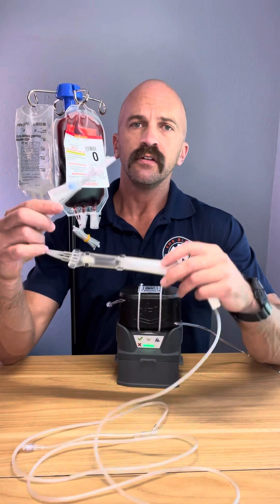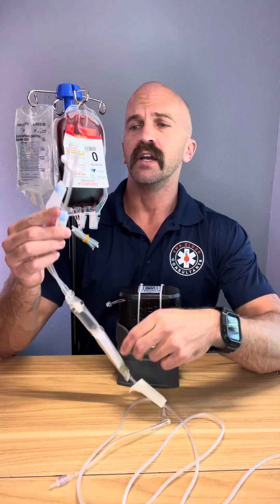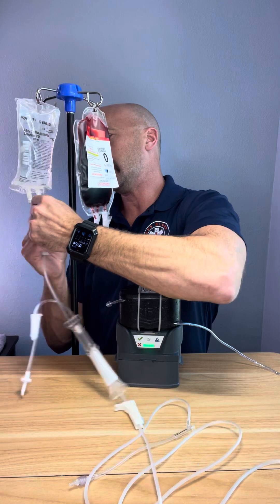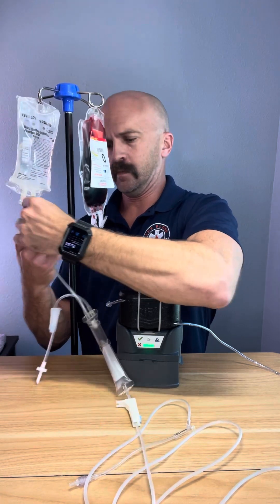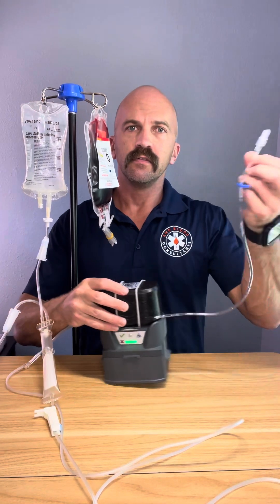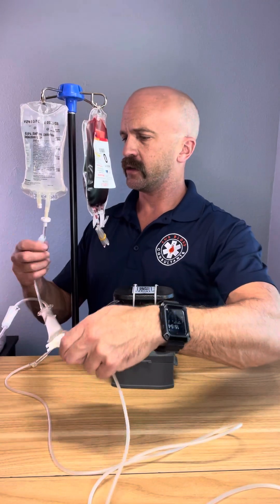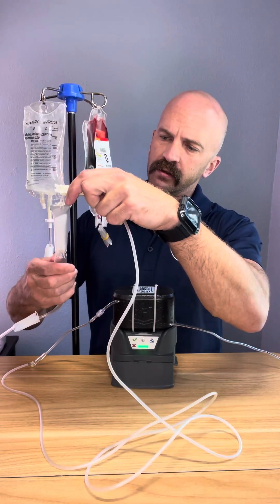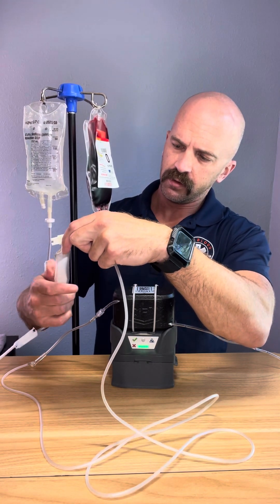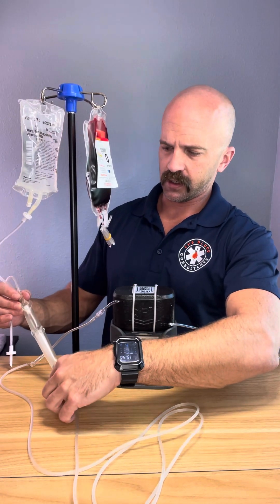I've got my blood tubing here — you can use any blood tubing. You want to make sure that it has a filter in it and a Y-set. We're going to start with saline. I'm just going to hook that up. This end here will go to my patient — my partner's starting that line for me like a good partner, getting a saline lock on. We're going to go ahead and fill the drip chamber up about halfway and let that start flowing.